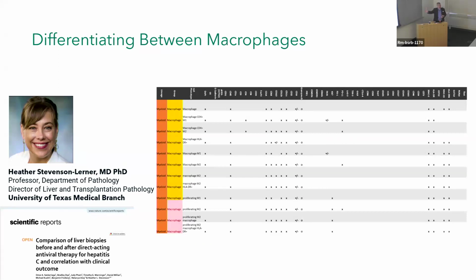And just by looking at the macrophages, they can start to create diagnostic-like tests to understand the difference between the staging of these types of patients. But with an 8-plex, she can only look at the macrophage markers. So we really want to start to be able to populate more and more biomarkers into the analysis that we're doing so that we can get a true picture of what's happening in the tissue.